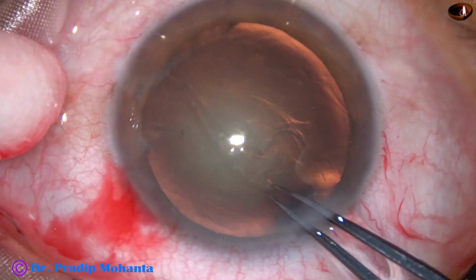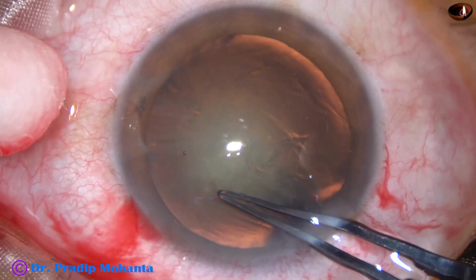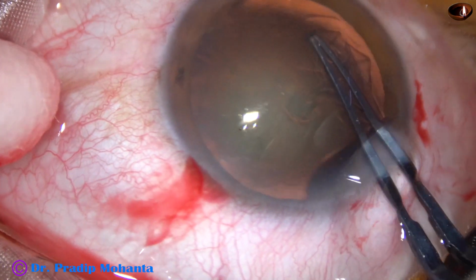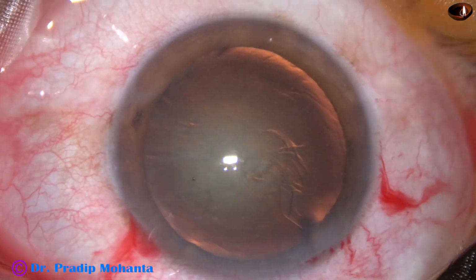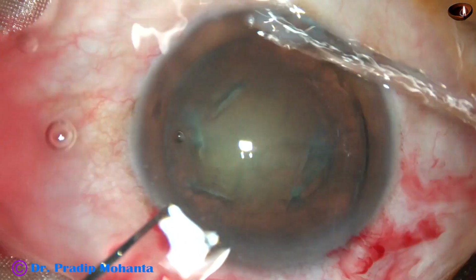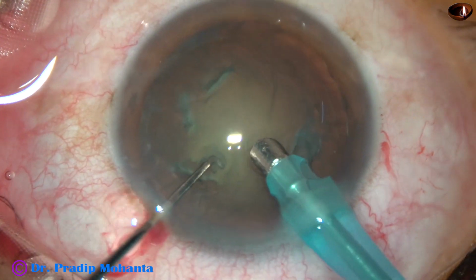I usually like to do capsulorhexis with Utrata forceps. I use Utrata forceps from Inami. And now see the chopper that I use.